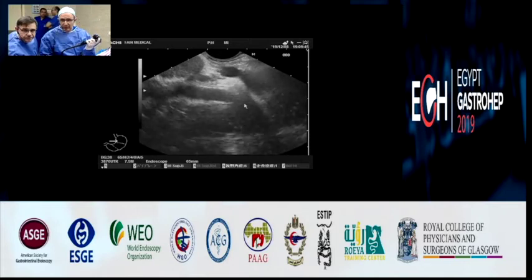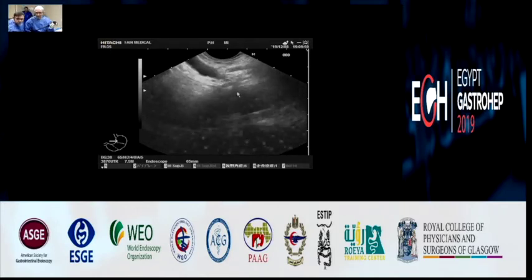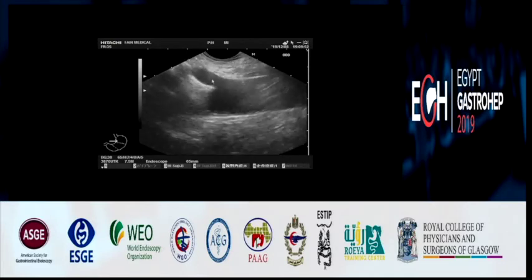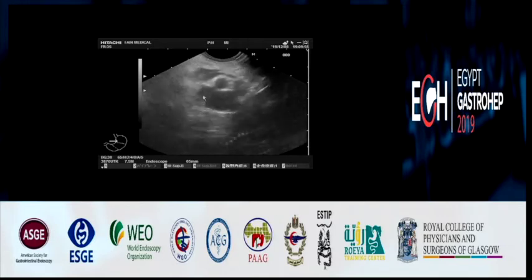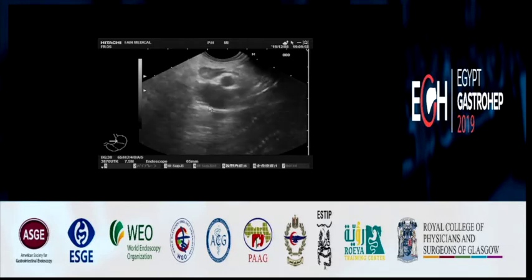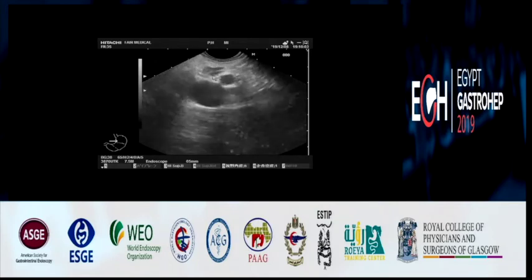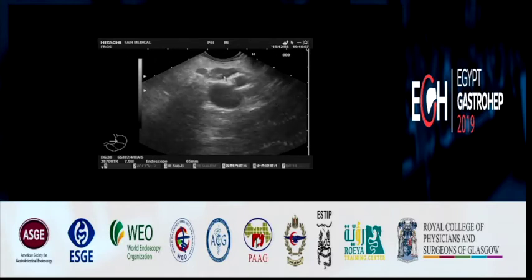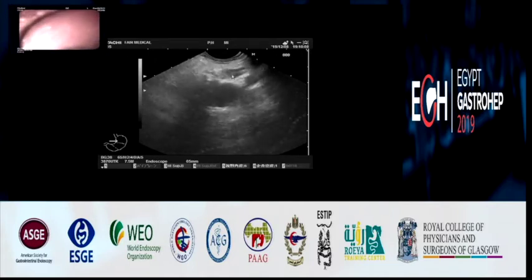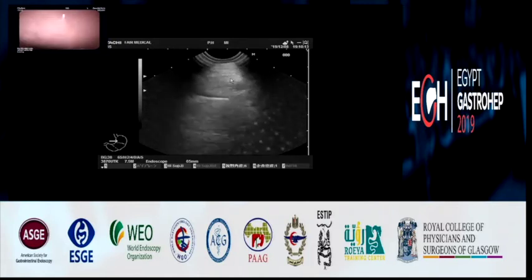Once again, the SMA, superior mesenteric artery, and just below it, we see the celiac trunk, and once again, the porta hepatis. If you had a dilated CBD, it would be just behind the portal vein, but you don't see it, right? There is no dilation behind the portal vein. It's an inflammatory lymph node, yes, probably. So, are you happy with this study? Perfect. Very good.